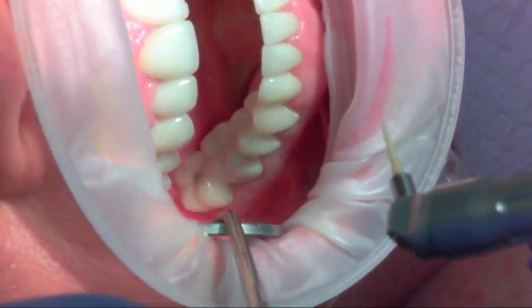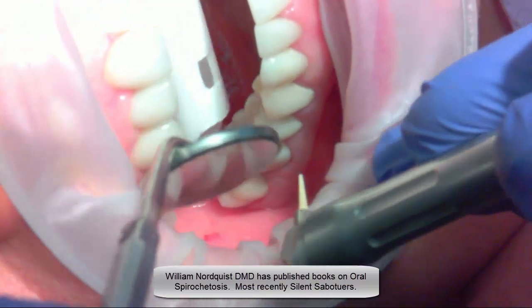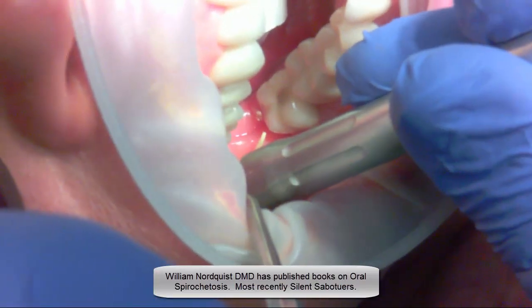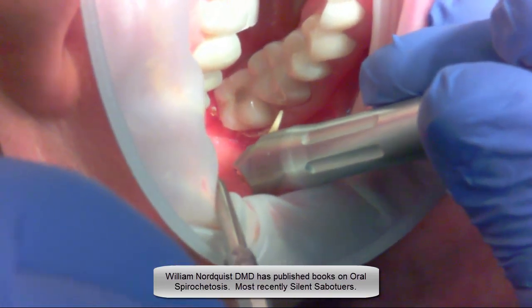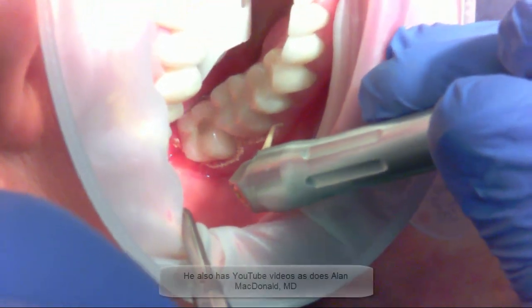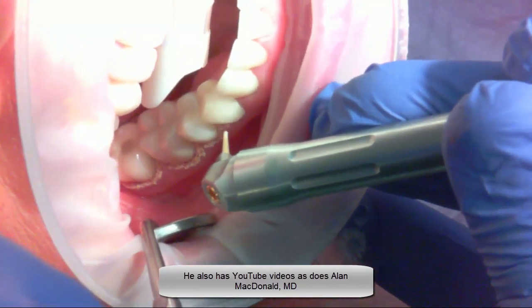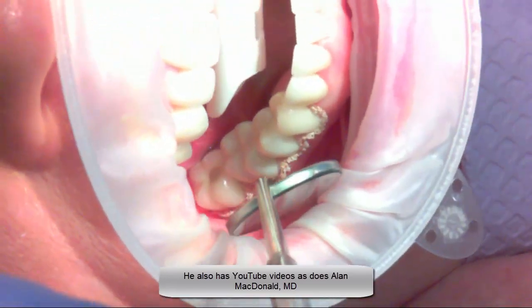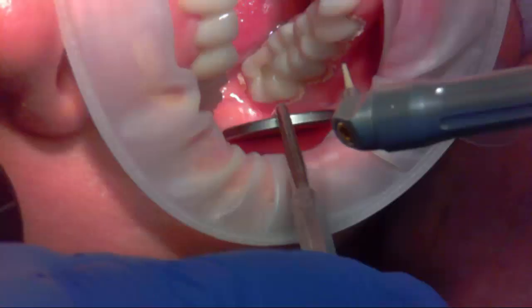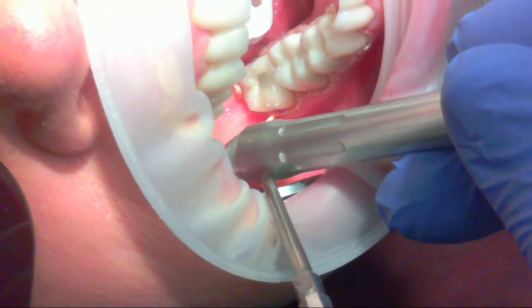You can see the tissues don't look too bad. Here I'm basically de-epithelializing the crest of the sulcus, doing this two to three millimeters around the neck of each tooth to make sure that as the sulcus heals it's bringing in all fresh new tissue. Anything embedded in this tissue is going to be evaporated. We use a band of about two to three millimeters around each of the necks of the teeth we're treating. For the purposes of this video, I'm going to be treating the lower right quadrant and the posterior on the buccal, but in reality we'll be doing this on the whole mouth. Then we insert the tip into the sulcus and very slowly move the handpiece around the sulcus while engaging the CO2 laser.